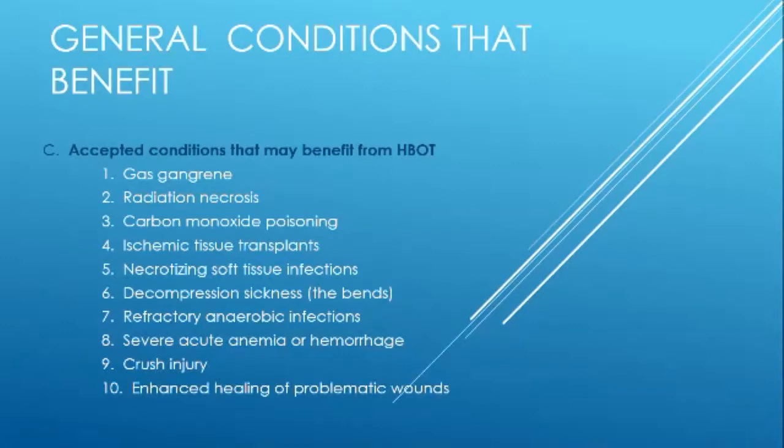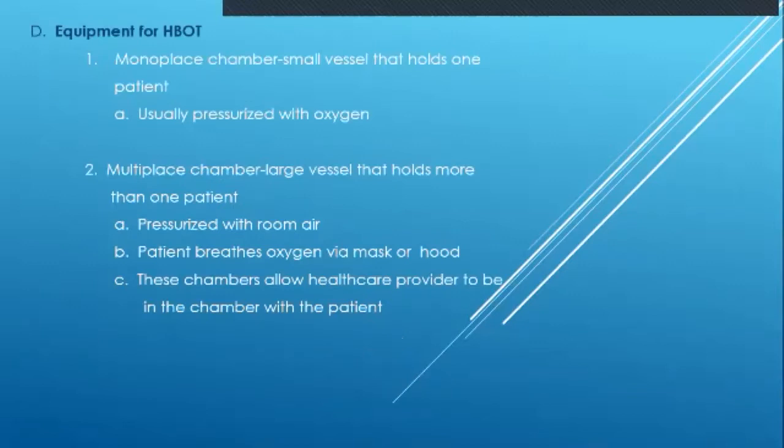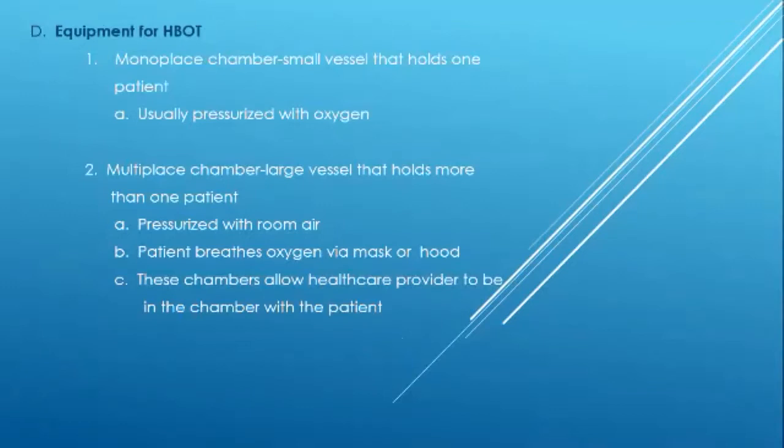And then enhanced healing of problematic wounds. You just got wounds that just won't heal. You have patients in the hospital, guys, that may have a bed sore as big as your fist. You can stick your whole hand inside of the wound, right? Because they've been laying on it for so long. And so you have those wounds that just won't heal. We can put them in a hyperbaric chamber.